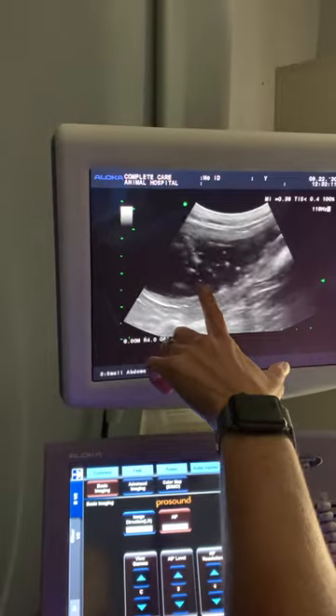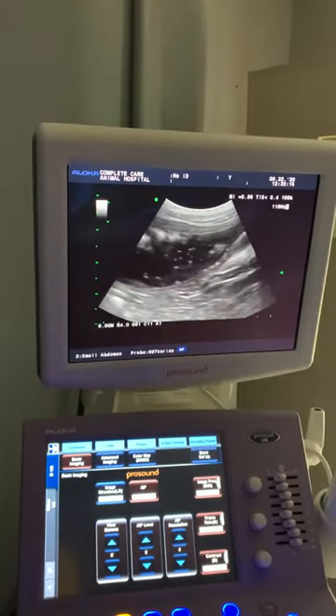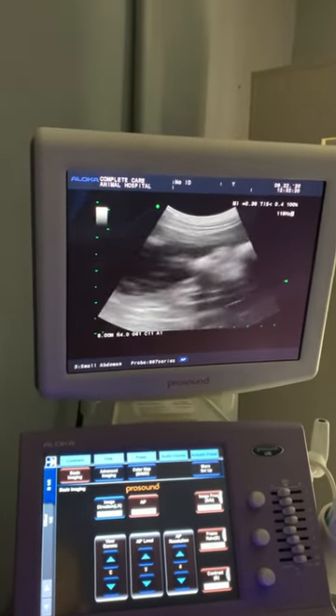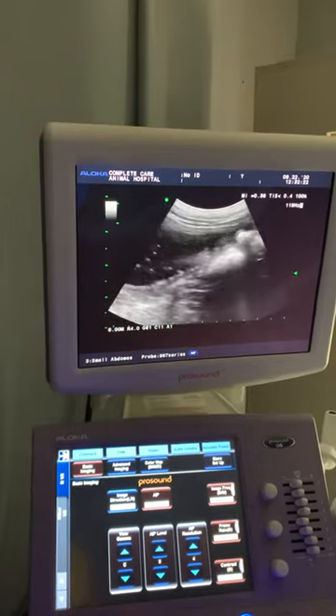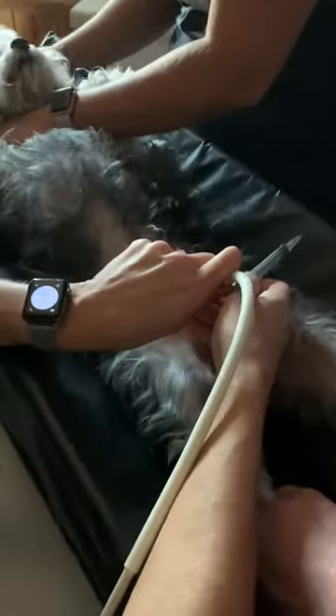We're going to get a sterile sample here right now. We'll send this out for culture and then we can recheck it, but if we didn't put the ultrasound on here we would never know that she had these stones sitting in here. Now, there are two types of stones: struvite and calcium oxalate. Struvite stones will dissolve on their own, but calcium oxalate stones need to be removed surgically.